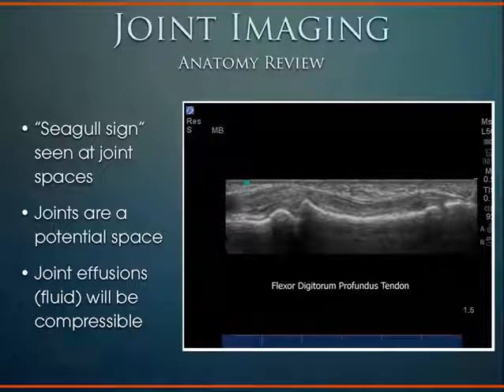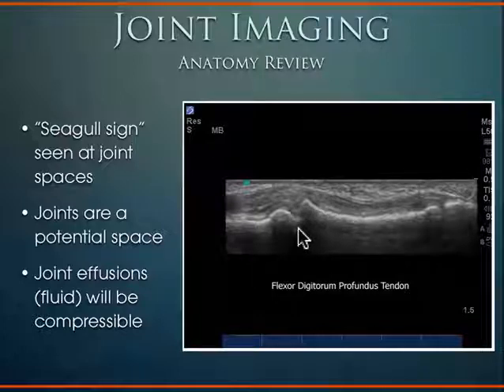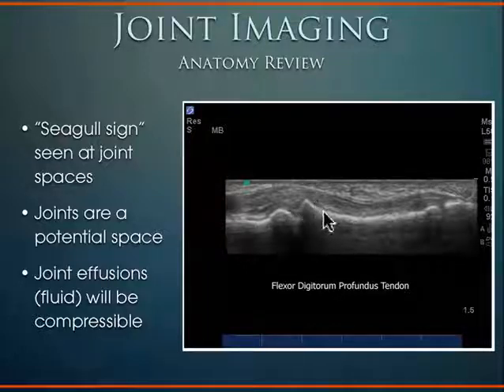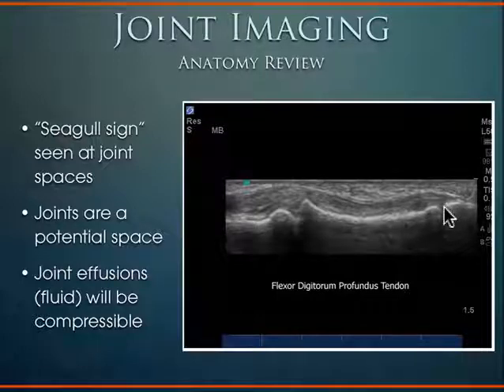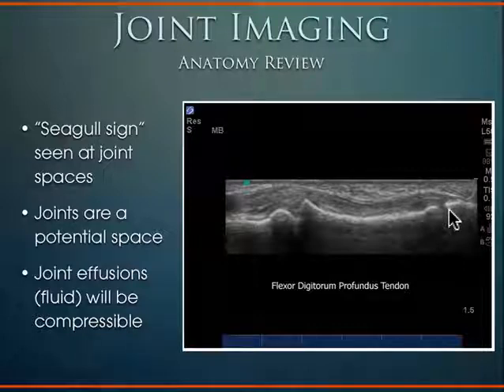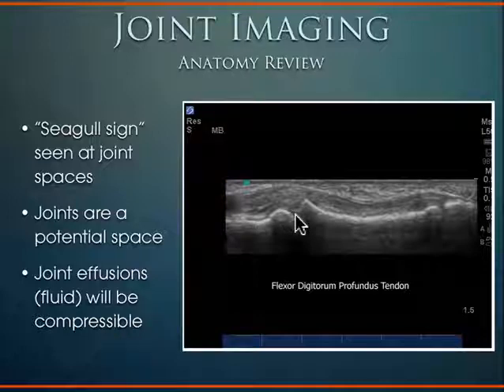Moving to joints and more bony anatomy. When looking at joint anatomy on ultrasound, it has this characteristic 'seagull sign.' This is the PIP joint — proximal interphalangeal joint. It has a joint space here, proximal articular surface, distal articular surface, and this kind of seagull bird pattern — a typical thing you'll see at joint spaces. The ultrasound does have limitations in terms of penetrating into the joint — there's bony tissue surrounding the joint space and you'll get shadowing deep to it. But you will be able to see the joint capsule fluid, fluid distension.